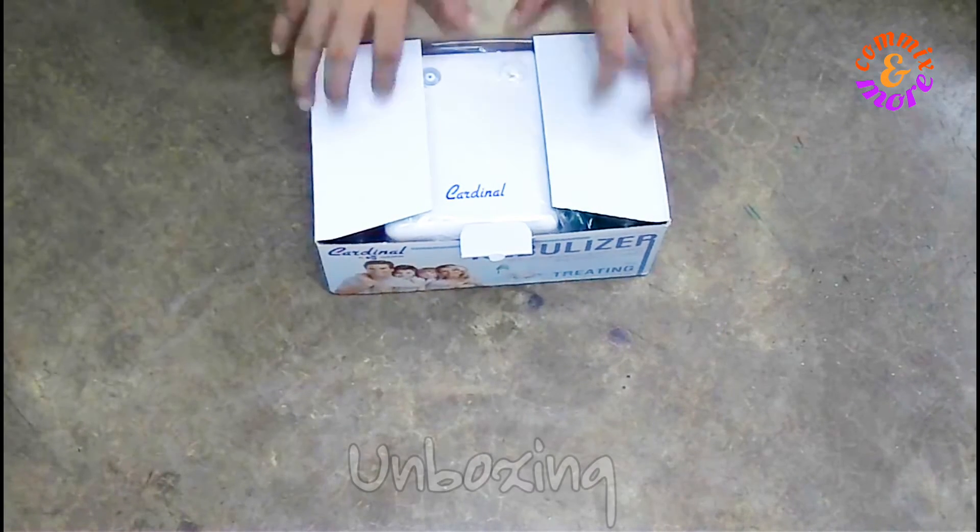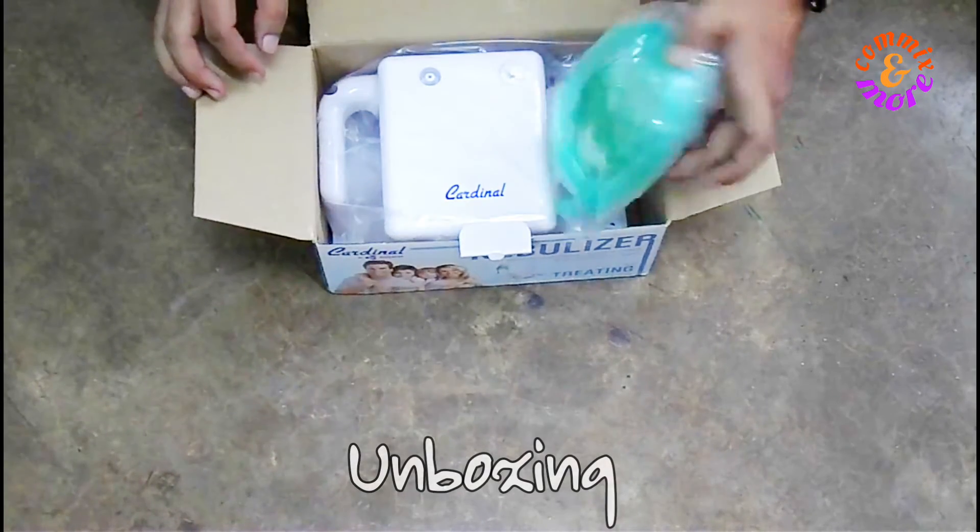The box contains the following: a set of face masks, the main nebulizer unit, and the manual.